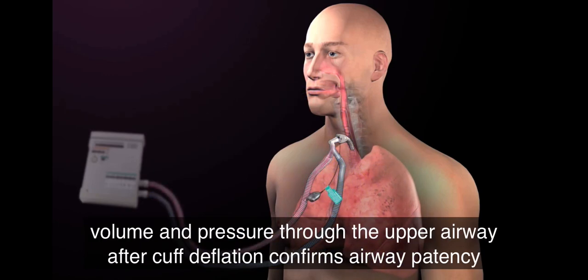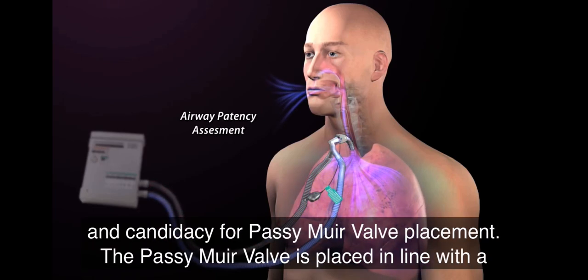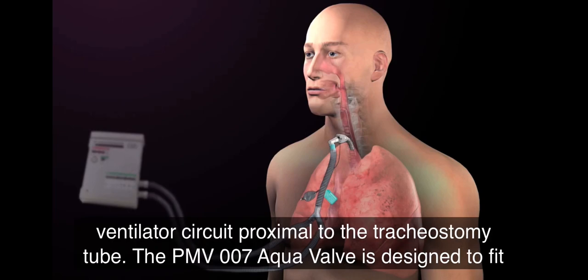The loss of volume and pressure through the upper airway after cuff deflation confirms airway patency and candidacy for Passy Muir valve placement. The Passy Muir valve is placed inline with a ventilator circuit proximal to the tracheostomy tube.